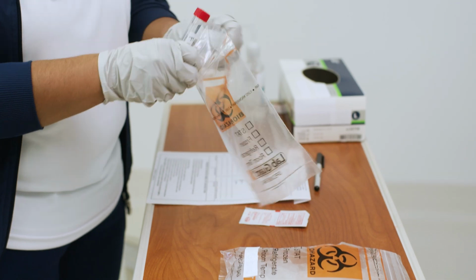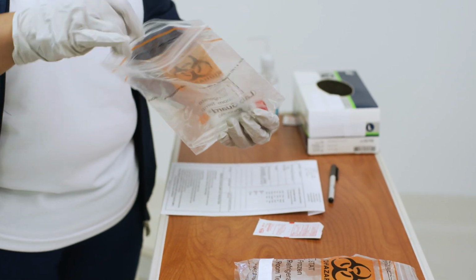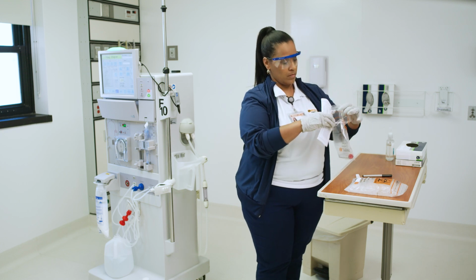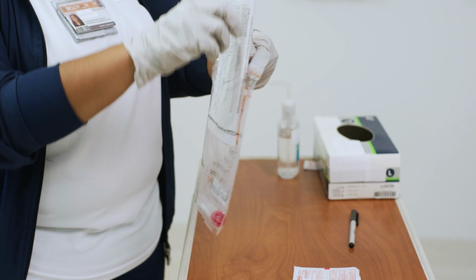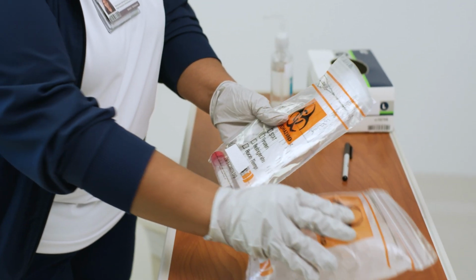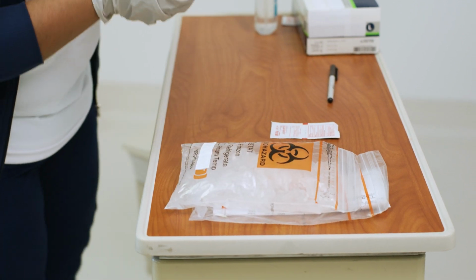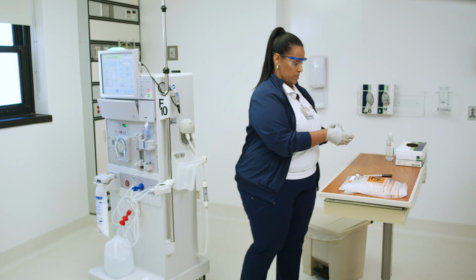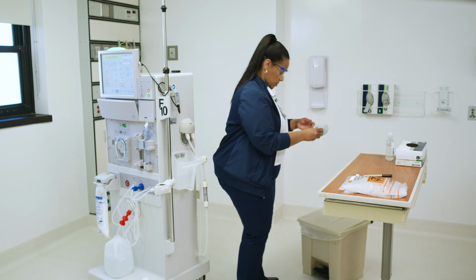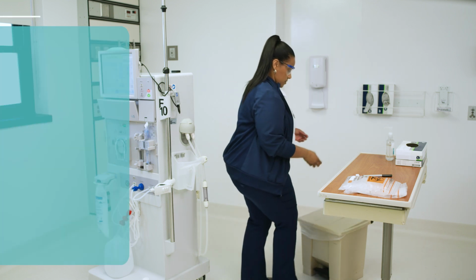Place your sample in a biohazard bag and attach the corresponding form. Place the bag containing the sample on a small bag of ice. Doff gloves and perform hand hygiene. These samples should be assayed within 1 to 2 hours of collection, or immediately placed in a temperature-controlled and monitored refrigerator and assayed within 24 hours.